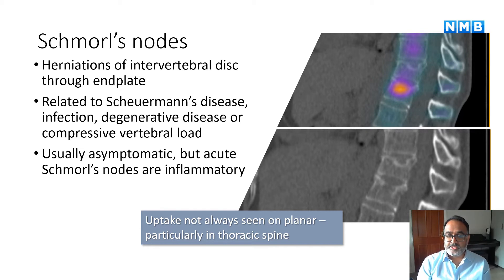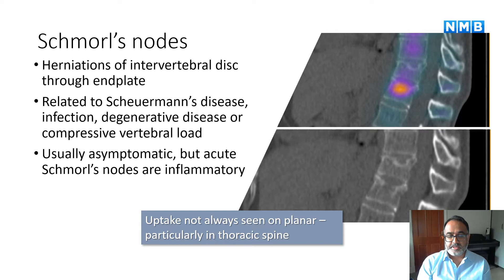Schmorl's nodes are herniations of the intervertebral disc through the endplate. They can be related to Scheuermann's disease, infection, degenerative disease, or compressive vertebral loading. They are usually asymptomatic, but acute Schmorl's nodes are inflammatory and can be painful, and are often avid on SPECT CT in the acute phase. In the chronic phase, the uptake reduces to normal background vertebral activity. Importantly, you may not see the uptake on a planar bone scan, so if you are concerned about spinal pain, you should perform a SPECT CT.